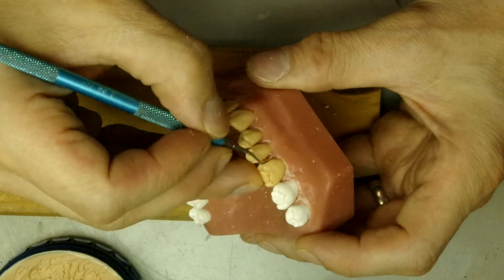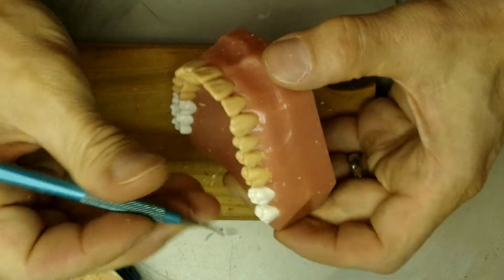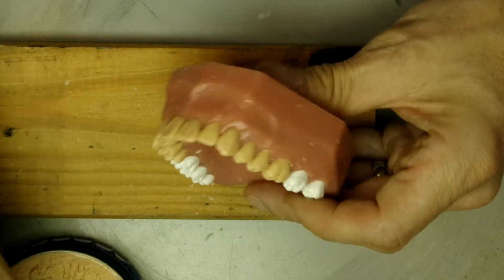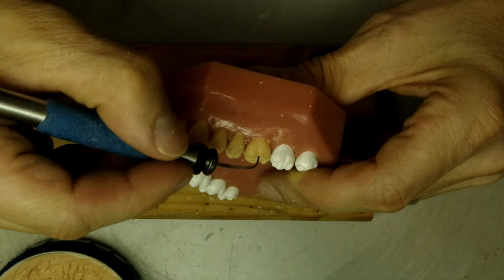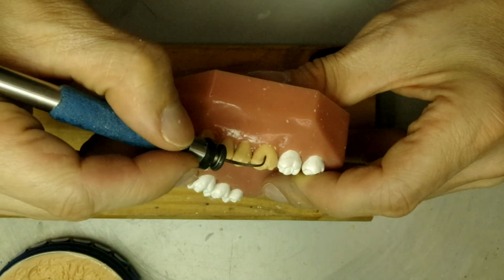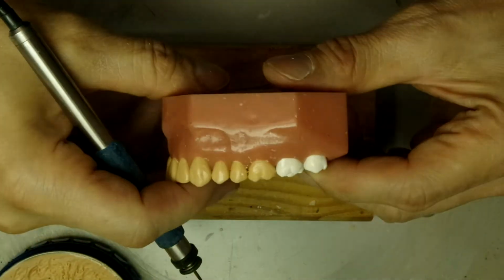So we need to have a little bit of roundness so that the teeth can direct the food away from the gum, so you don't make the pockets too deep. I think that should be okay.